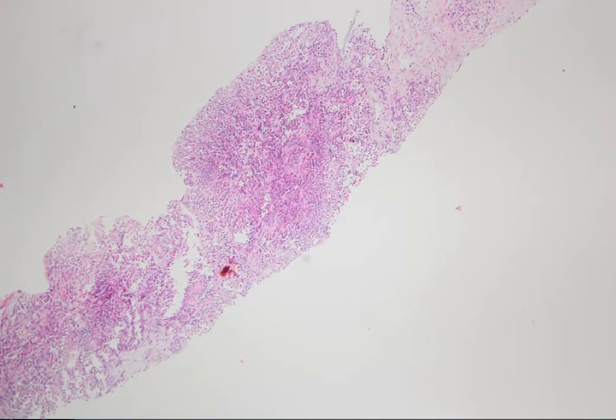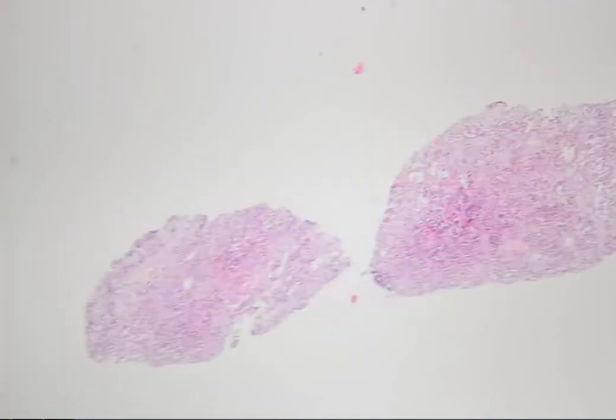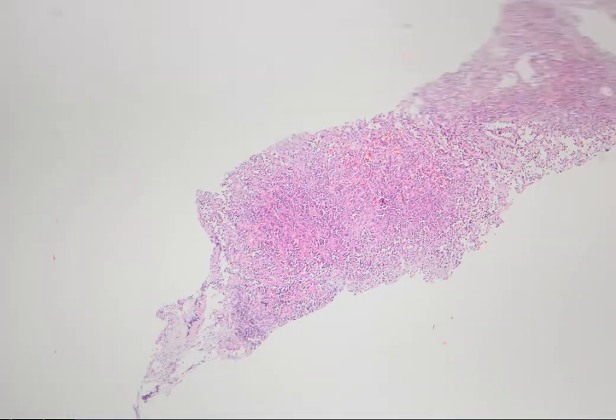I also ordered some markers used for adrenal, like calretinin, inhibin, and melan A, but they were all negative. And he reminded me of the basics. So I turned back to look at the case again.